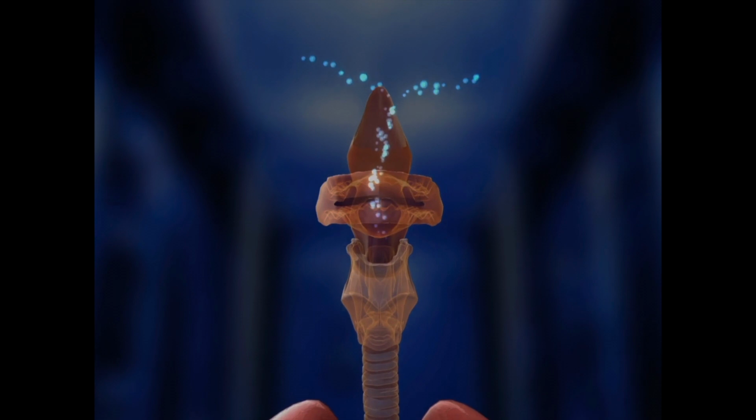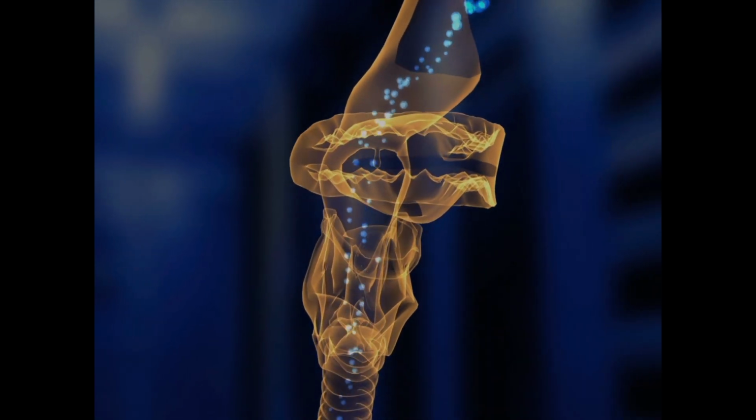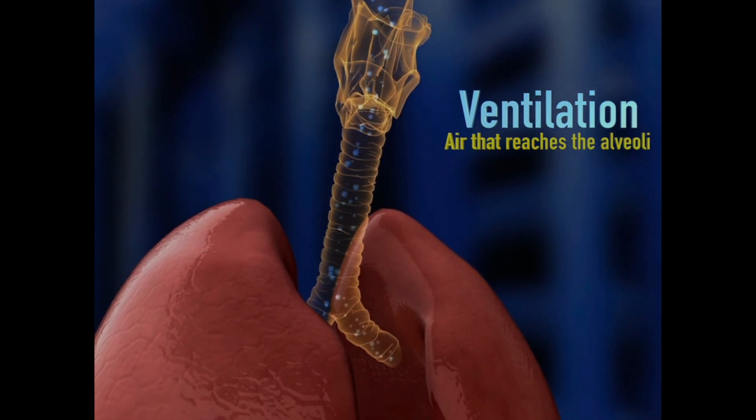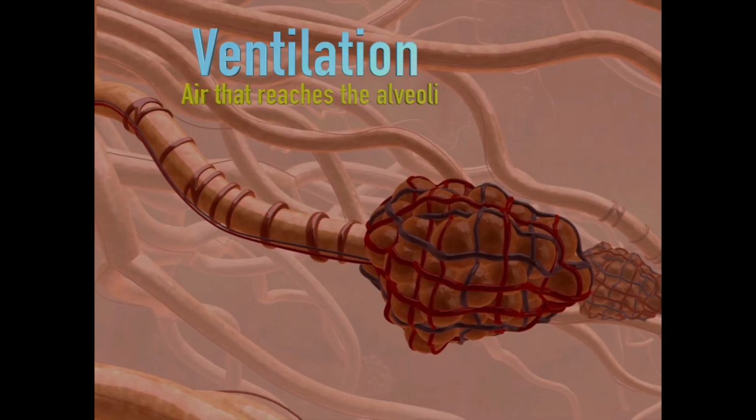Now, let's quickly circle back to this idea of capnography being real-time ventilation. Capnography is known as real-time ventilation because with every single breath exhaled by the patient, a measurement of CO2 is being observed and can be used to consider the patient's current status.